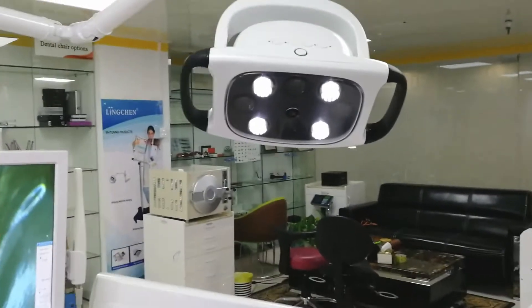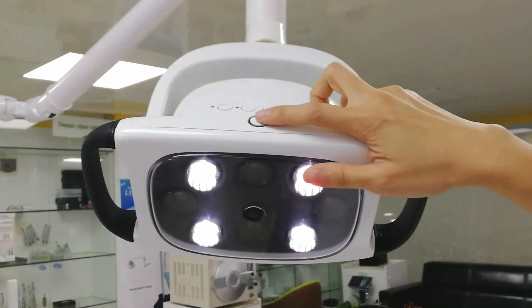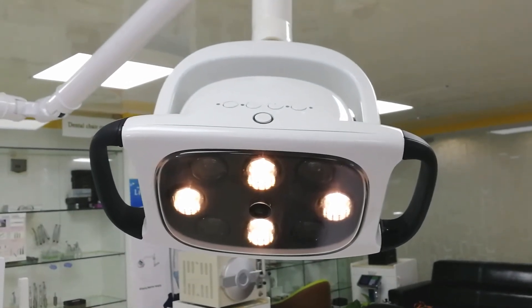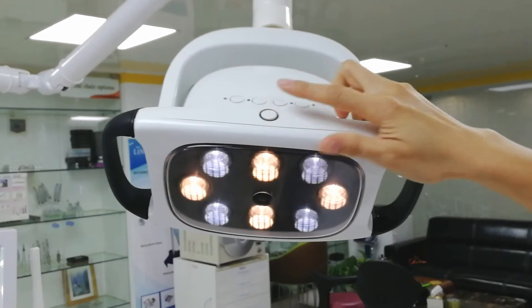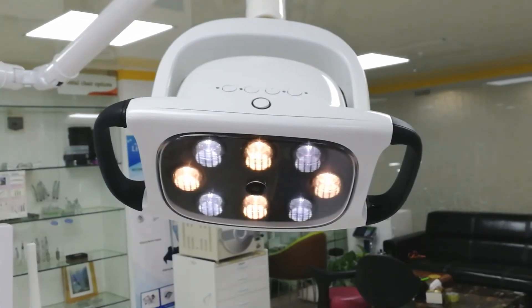Now let's see this new LED light. It comes with speed options. When we do composite filling, we will use the yellow light — you know how white light affects our filling workflow. If you want to detect the color of the teeth, you will use the white light and yellow light together, which gives us a very good result.